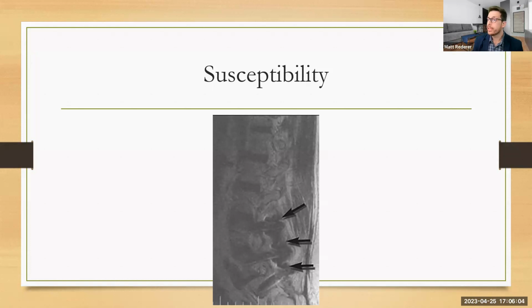So if we have an object like tissue, which is diamagnetic, and air, which is paramagnetic, and we have an interface between the two, such as the sinuses, right? If I'm imaging the brain and I have sinuses and then brain tissue, there's a very drastic change in magnetic susceptibility, and we can get this artifact around those areas, depending on the pulse sequences that we use. So this is pretty common.